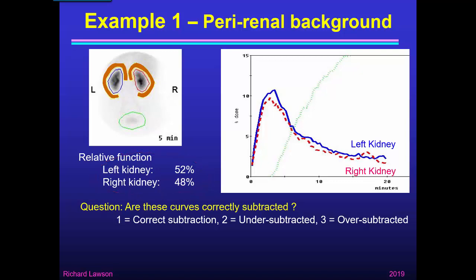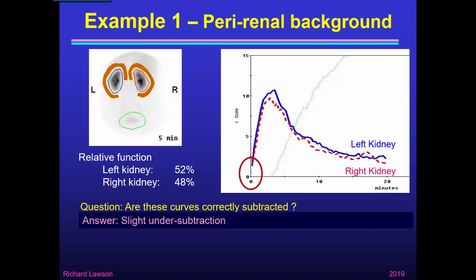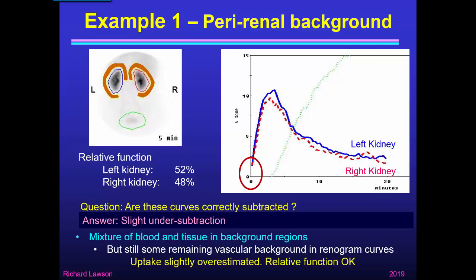I think there's still slight undersubtraction. You can see that neither curve starts exactly from zero, but they're not far off. We've chosen a background region which has a mixture of blood and tissue, but there's still some remaining vascular background in the renogram curves. So although the uptake has been slightly overestimated, because it's the same for both kidneys, the relative function is probably still okay.